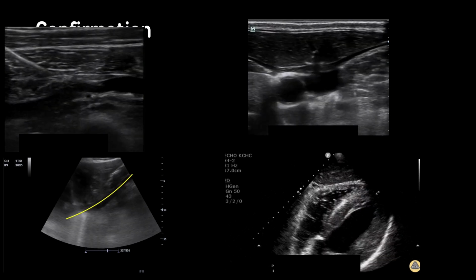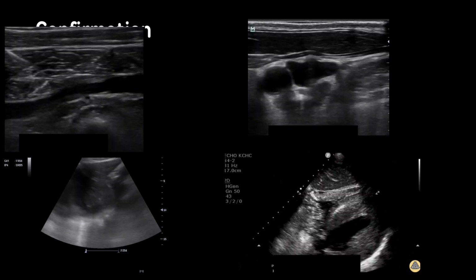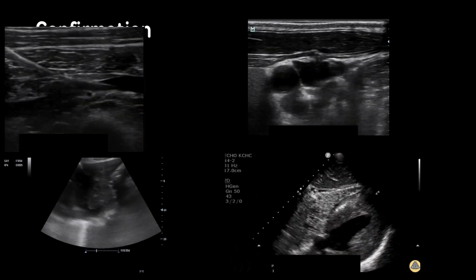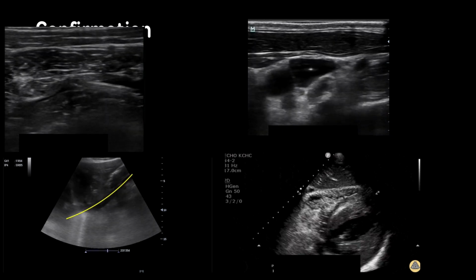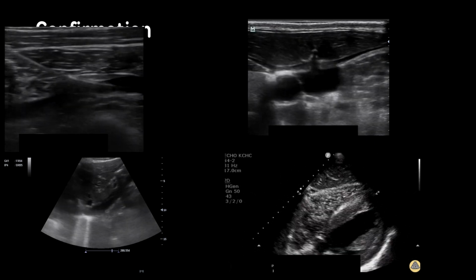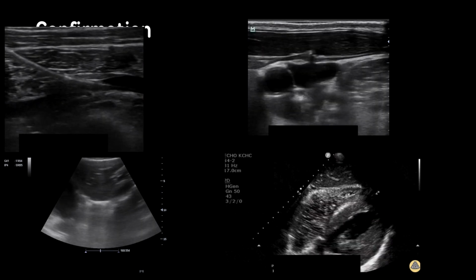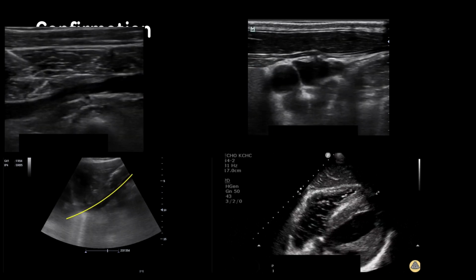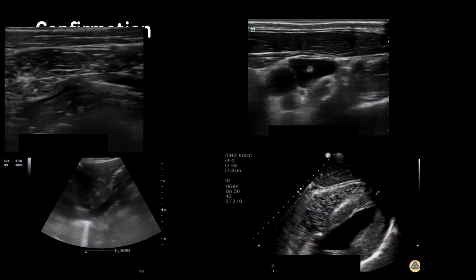Yeah, you follow the wire. Look, it's not always that easy with the pacemaker, because the wire we normally put in the internal jugular. So then I will usually look sub-xiphoid and just see the wire sitting in the atrium, because you need to float the catheter up to the RV. So oftentimes you can see that it's not in the RV. You need to come back, push it forward.